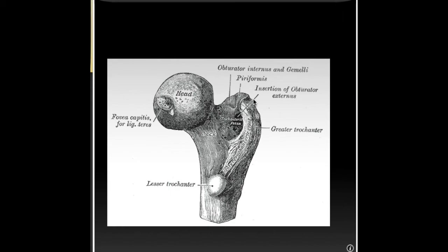Going back to the matrix, that's something that we're going to use to distinguish whether we're thinking more of a cartilage-based lesion or a bony lesion like an osteosarcoma, with bony matrix formation. And for that, we think that the x-rays are better, and by that same token, the CT.